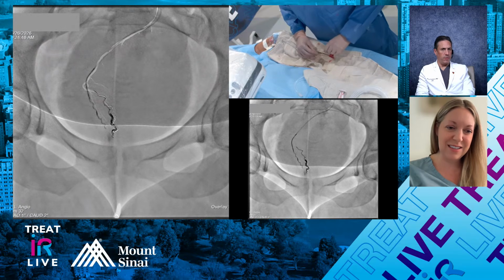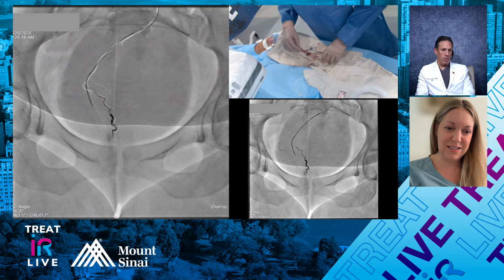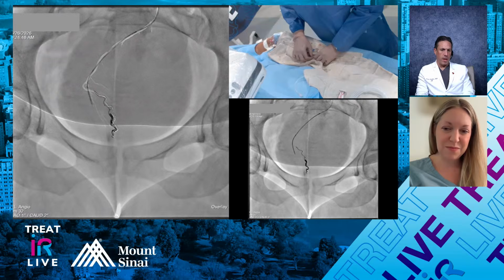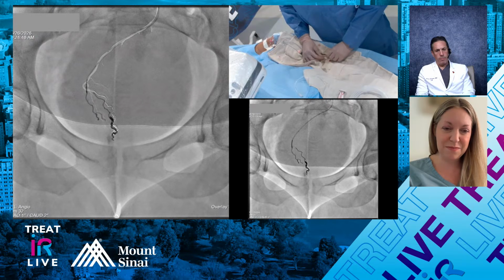If we were going to use a liquid for a procedure like this, I think we would need something aqueous, not DMSO or adhesive like glue, where we could reuse the microcatheter. There's no bifurcation there, I think. And if you don't worry about getting into it, it'll be fine. That would be key here. Let it go and then let it flop down to the bigger one. Oh, there we go. Just like that. Beautiful.